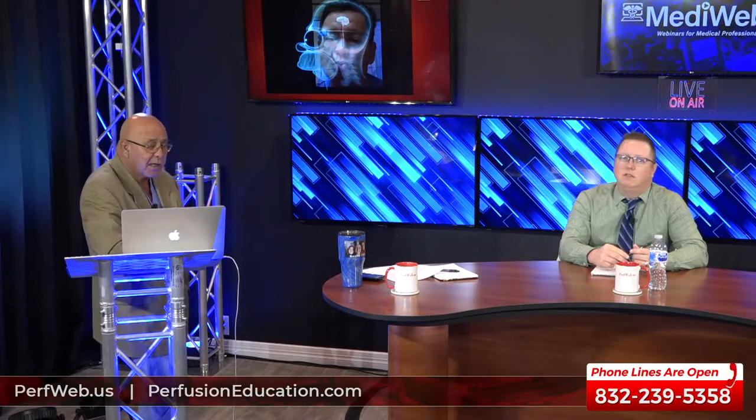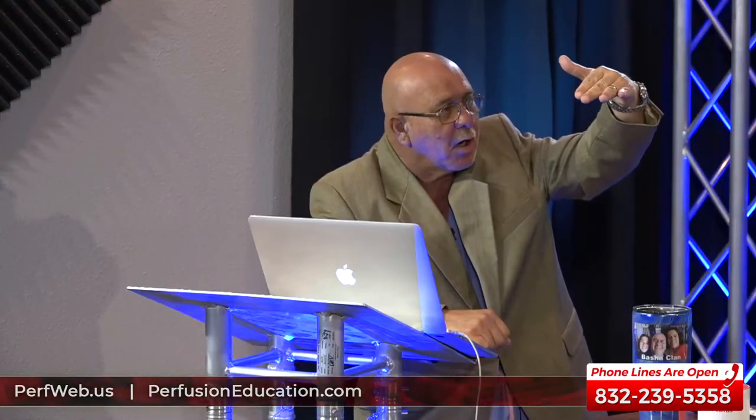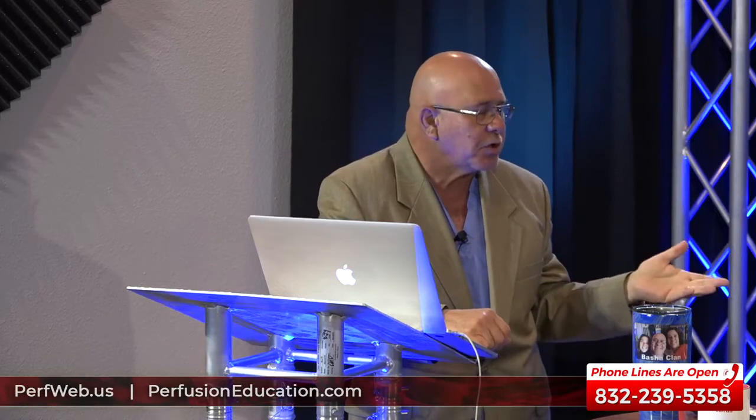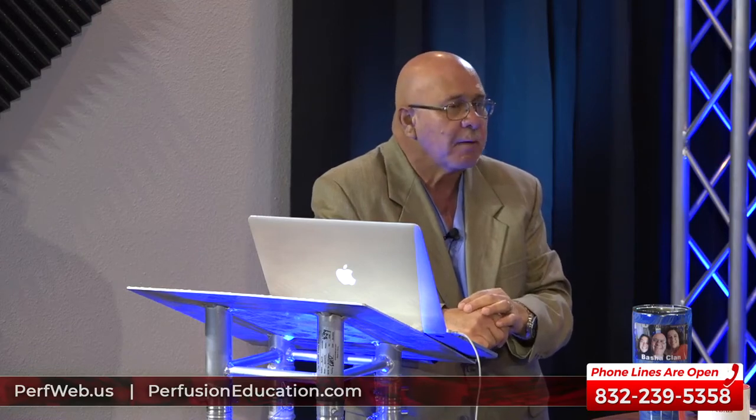I think that there are two different ones. I showed you the Sentinel, the Claret one, or the Sentinel Claret. And then there's another one, I can't remember the name of it, but it basically covers all three of the arch vessels. The Sentinel is an embolic collection device. This other one is a deflector. It's essentially a net that goes around the aorta where the arch vessels are, all three, and anything that hits it will go downstream to where hopefully it wouldn't do as much harm. Right. So that's how that works. So there are two out there.